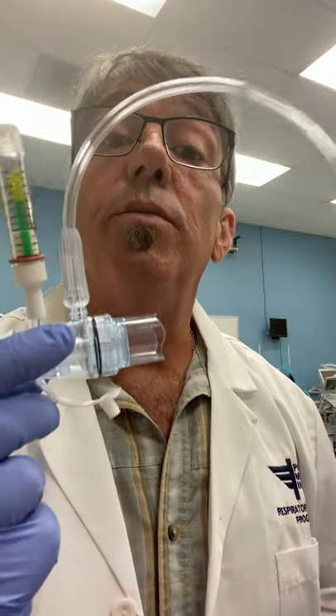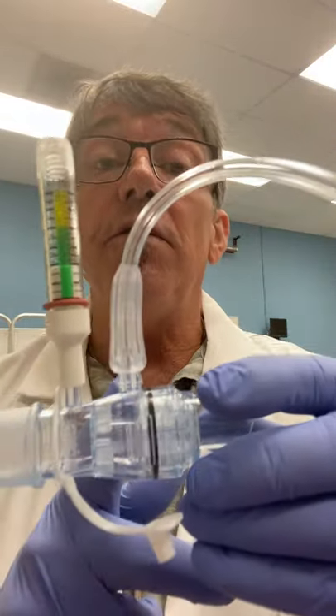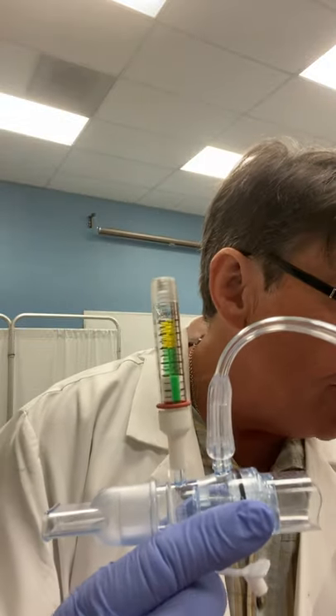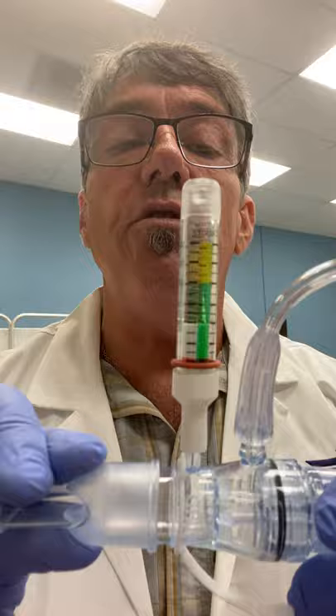The other end of the oxygen tubing connects to an oxygen or air source flow meter. I like to start at about five liters a minute. That gives a good amount of flow into the EZ-PAP and creates a decent amount of resistance for the patient to expire against. I'm going to set that to about five liters right now and you'll hear the typical sound that you'll hear with the EZ-PAP.